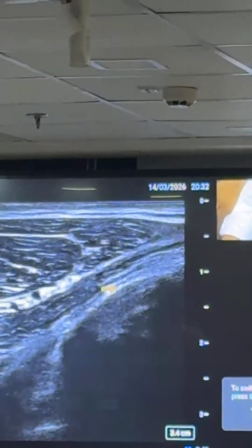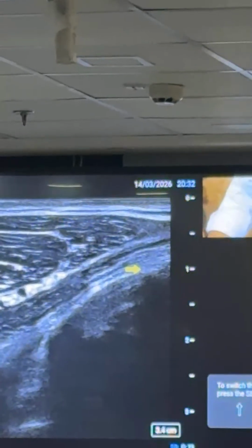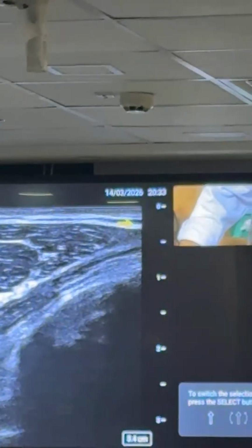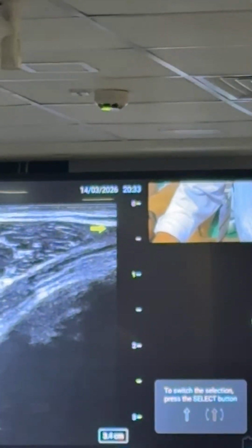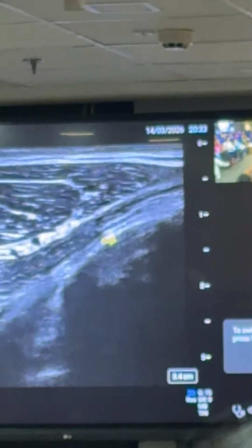But if you are going deeper, that is going to block the lateral intercostal branches, leaving these two motor nerves. So these are basically the two planes that are normally described for this. In this case, if you see again, there is a rib there, you can hit the rib and open up this plane. The drug is beautifully spread in this plane.